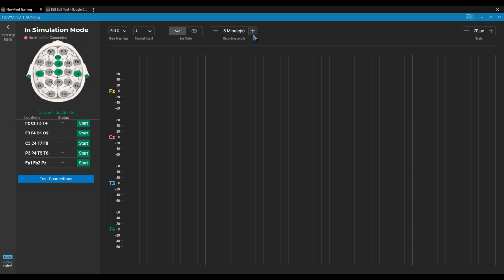You're going to run into those clients where mapping them is just going to be a chore, and unfortunately, there's no way around it.